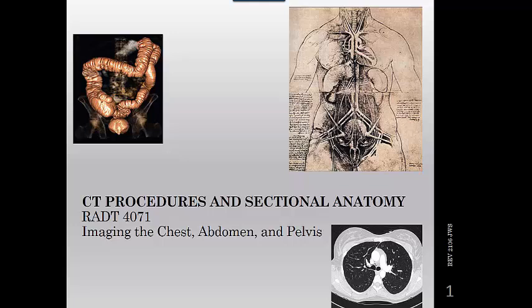An example of that is when scans are done for screening, detection, or exclusion of pulmonary nodules or primary lung diseases such as emphysema or fibrosis that are typically done without contrast. IV contrast is used to differentiate vascular from non-vascular structures as well, and to further characterize lesions by observing their pattern of enhancement.